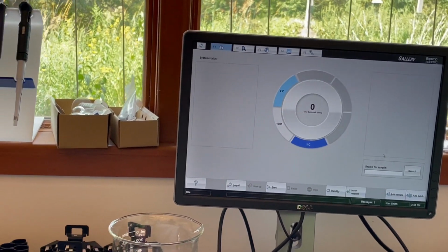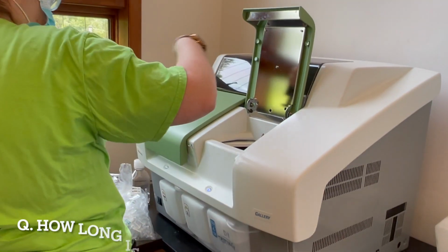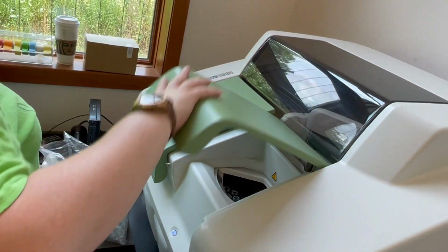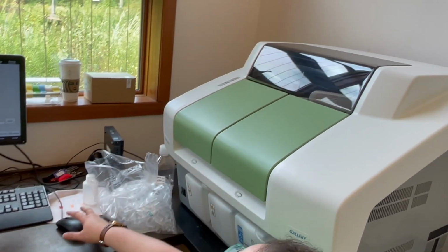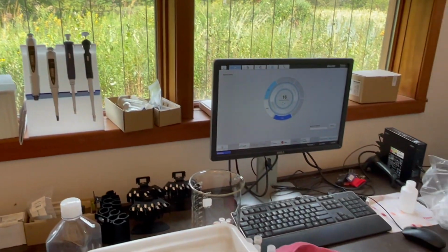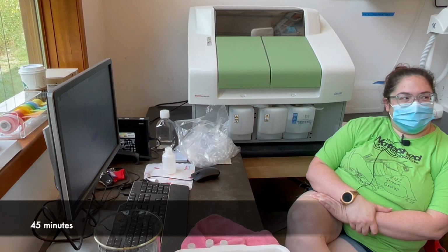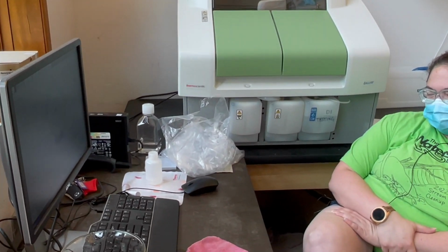Okay, so now that we've got our calibrations accepted, I'm going to put these samples in. How long is the sample run you're doing? It'll let me know in just a sec. Oh, okay. 16 minutes it says. That might be a lie. It lies sometimes. It changed, it's 40 minutes. Yeah, see, that's what I thought.